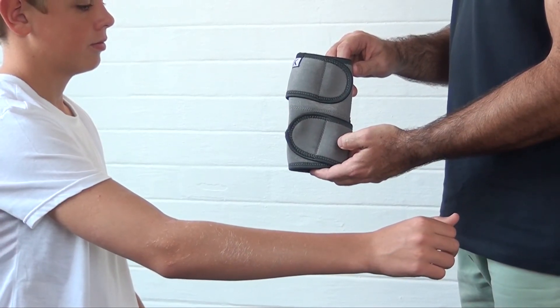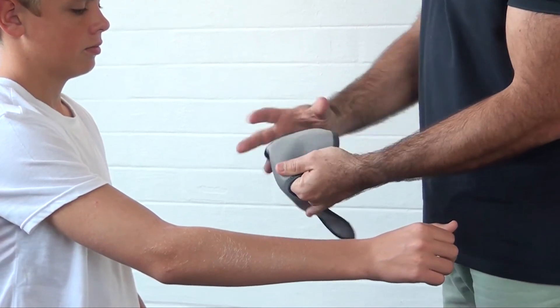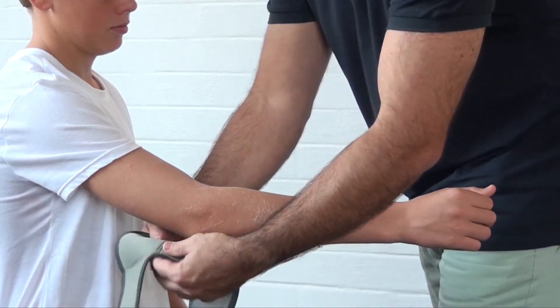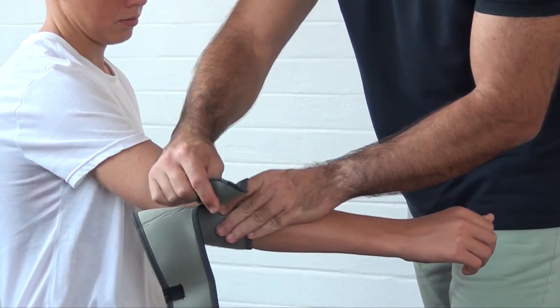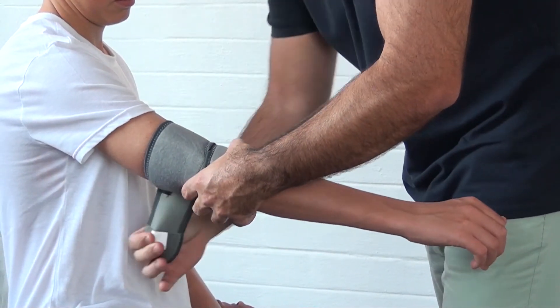Let's have a look to see how we can fit the elbow support. The first step would be to loosen the lower and upper Velcro attachments. Fit the brace securely around the elbow joint, then attach the lower support strap followed by the upper support strap.